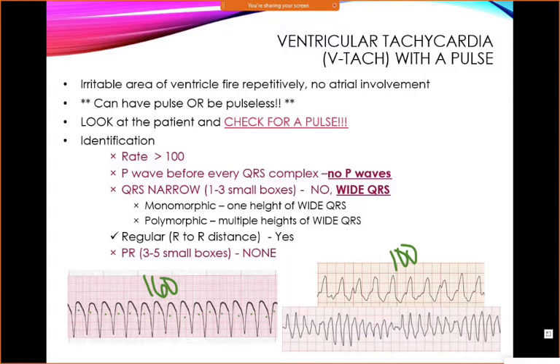There is no PR. There's no Ps. Just these wide, weird things. Now, a lot of you will want to go in and bring the code card into this room. I will tell you that VTAC, because it is somewhat regular, can be pulsed or can be pulseless.